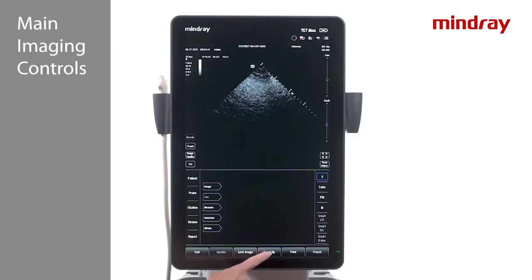To save a clip, press Save Clip. The system is set to either take prospective or retrospective clips. If prospective, the display will show seconds counting down. To print an image to the optional onboard printer, press the print key. The system will need to be plugged in to print. Save an image and print later if not plugged in during the scan. An application specialist can configure the optional onboard printer.